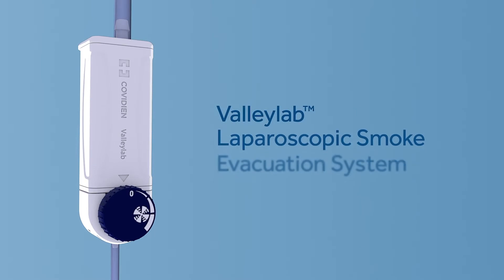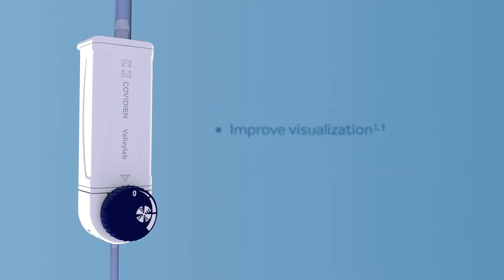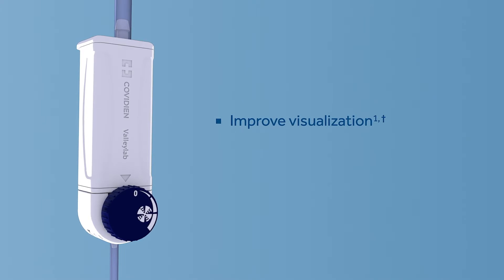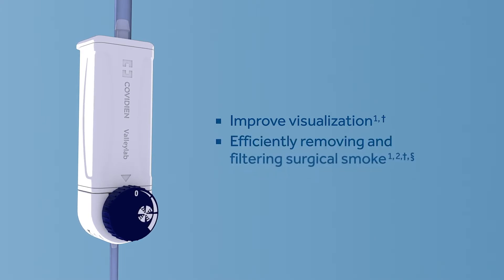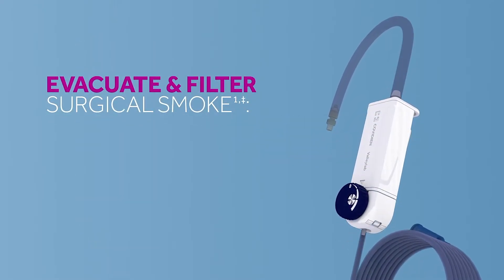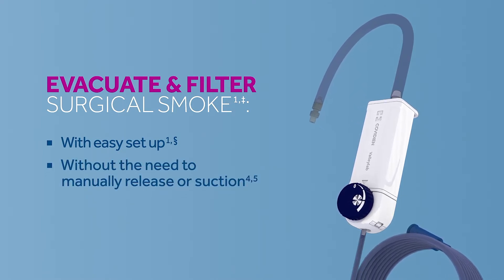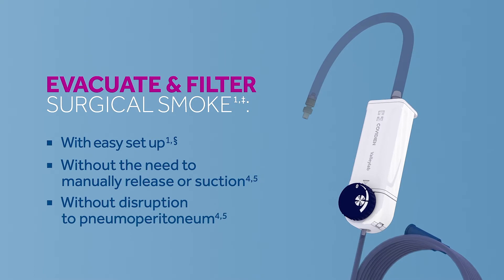The ValleyLab Laparoscopic Smoke Evacuation System is designed to improve visualization in your laparoscopic procedures by efficiently removing and filtering surgical smoke. The device evacuates and filters surgical smoke from the peritoneal cavity. It's easy to set up, doesn't require the suction of built-up smoke, and won't cause disruption to pneumoperitoneum.